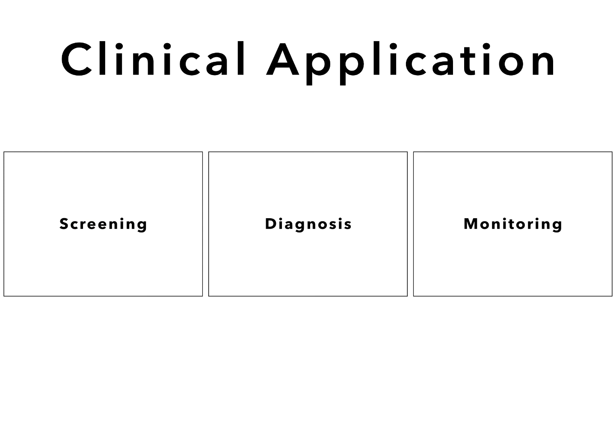Screening for COVID is going to be very much context-specific and location-dependent, and most screening programs I've heard about assess patients using vitals, pulse oximetry, and clinical assessment. From a diagnosis standpoint, ultrasound is extremely helpful in assessing other etiologies of dyspnea. However, no imaging test is diagnostic for COVID. Lung ultrasound may very well have similar sensitivity to CT for COVID, but this hasn't been confirmed yet.